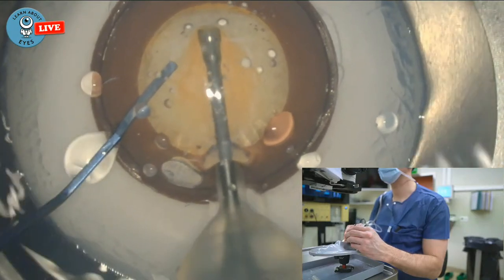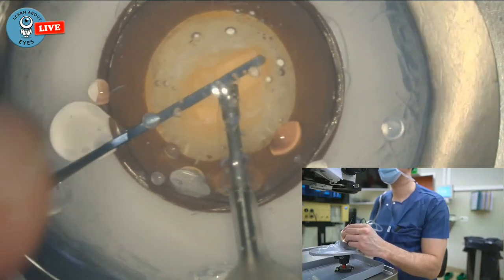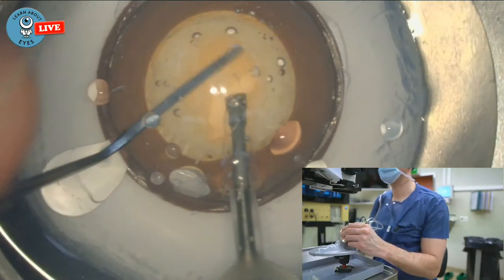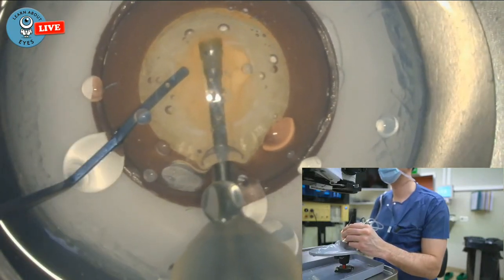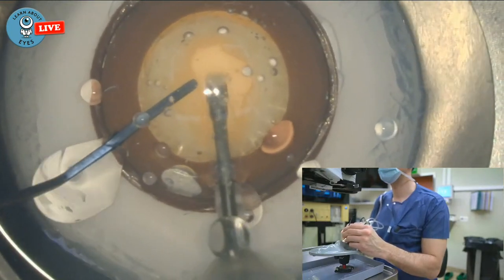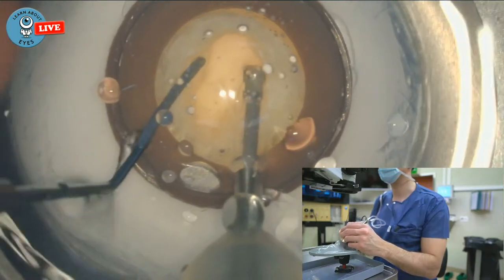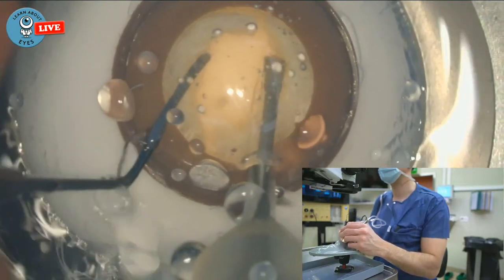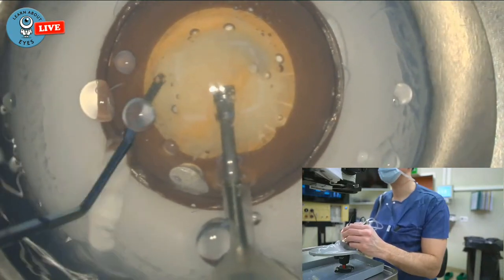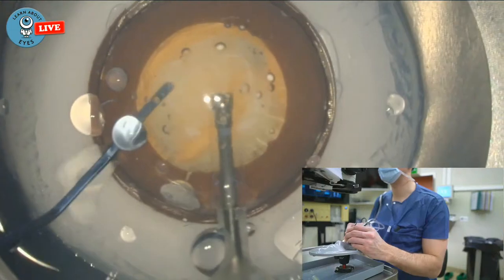Of course, you should never go this far out in a real eye. Now we're gonna rotate it a bit more to this side. Should be fine. Maybe we can crack it now. Yeah, there we go. Okay. Now we've got like two halves now.